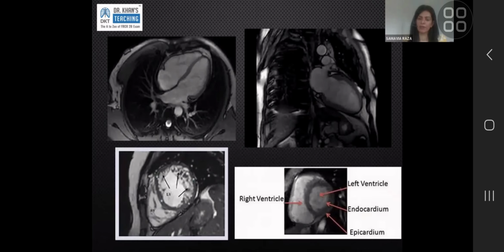modify your protocol accordingly. Radiologists sometimes sit in the scanner. When such a patient comes, if the radiographer isn't sure about what they're looking at, they can't figure out what is going into where, what the anatomy is. That's how you help them plan. Patients who have shunts or post correction of congenital heart disease can have strange shunts or strange connections. Those connections also need flow imaging or contrast. You need phase contrast imaging to see how much flow is going through those, because over time the abnormality these patients get is stenosis.